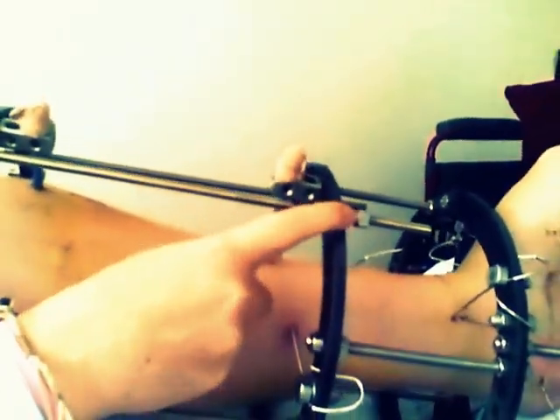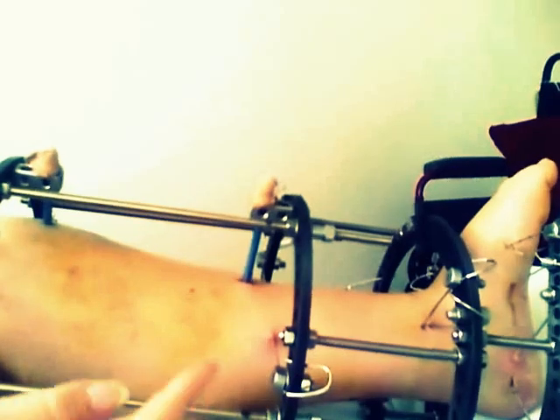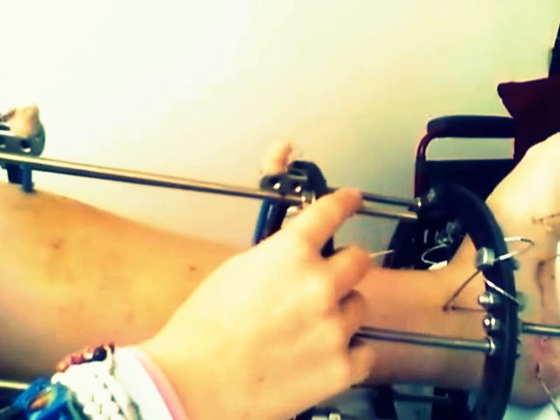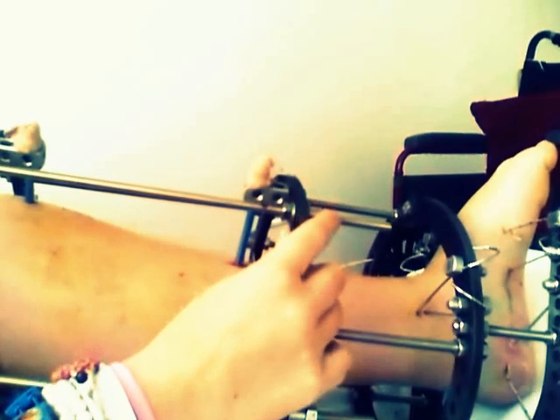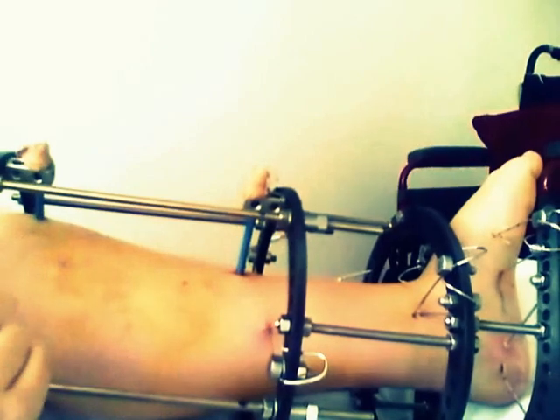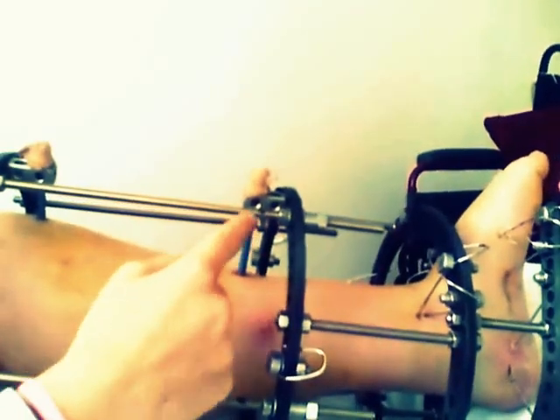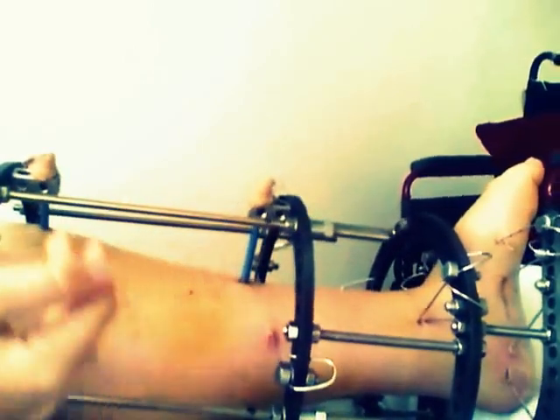What you have to turn is this here, and it's like a dice basically with 4 numbers on. In the morning you turn it to number 1, then at lunchtime you turn it to number 2, then at dinner time number 3, and then back to number 4 in the evening. So you do that 4 times a day, which means you grow 1 millimetre a day, and this is day 14 for me, so I have grown almost 9 millimetres, which is almost halfway there. Not quite, but you know.